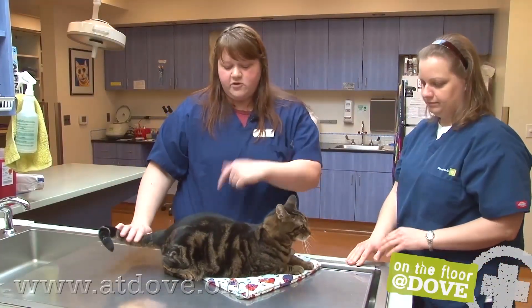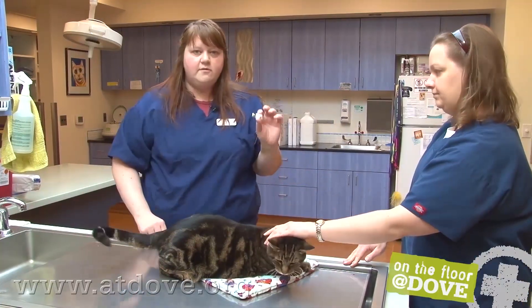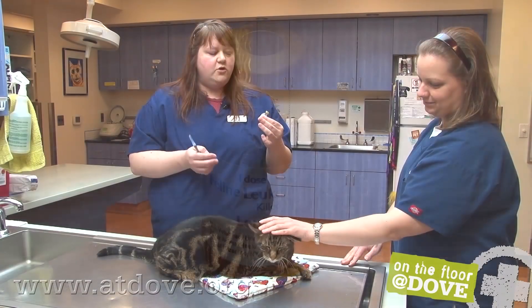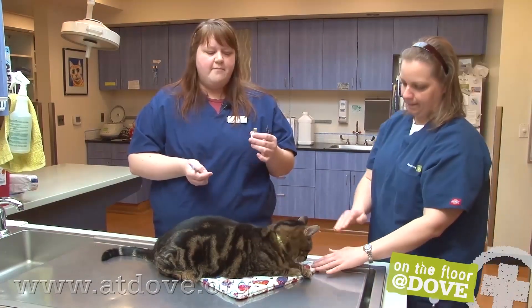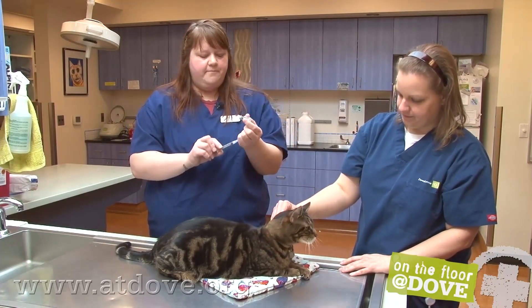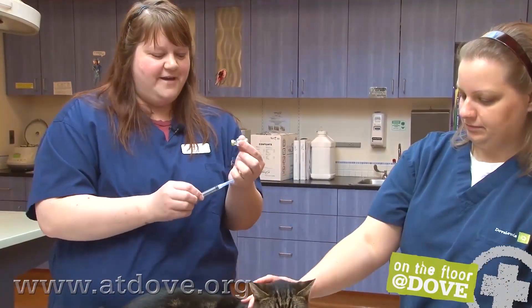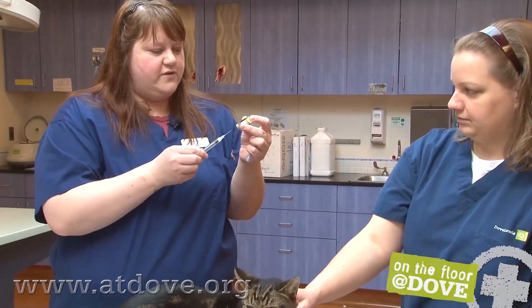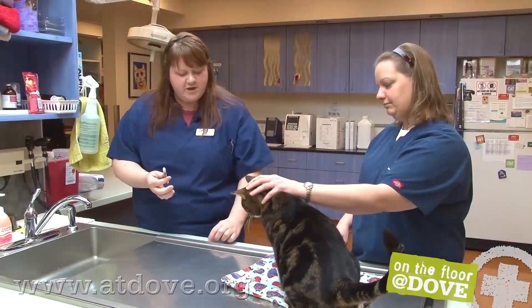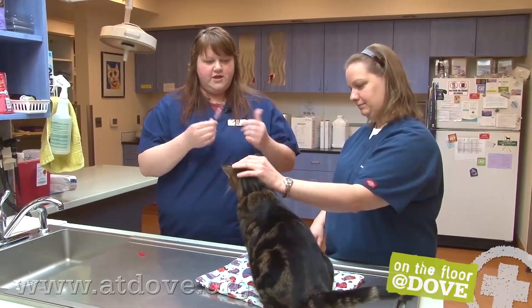He is actually getting a leukemia, so we're going to go on the left side. The leukemia vaccine comes already made up, so it's not something that's freeze-dried that you have to mix. Those ones you want to mix right before you give them and make sure everything dissolves in the bottle. We use Luer-lock syringes just so that the needle isn't popping off in case the cat moves. I'm just drawing up the entire amount. We always change the needle — for cats I like to use a 25-gauge needle.